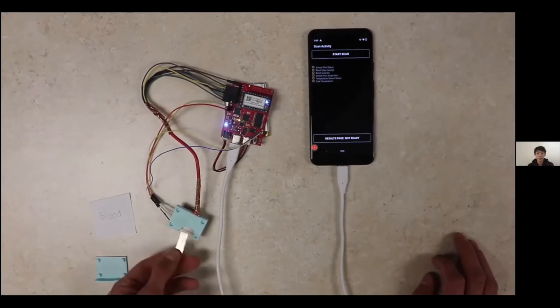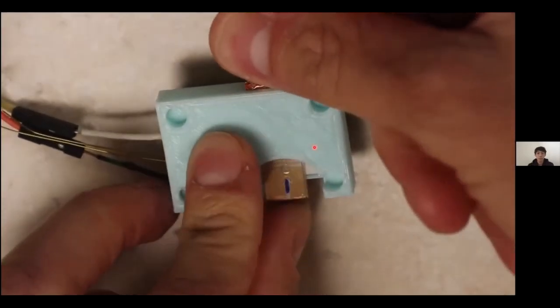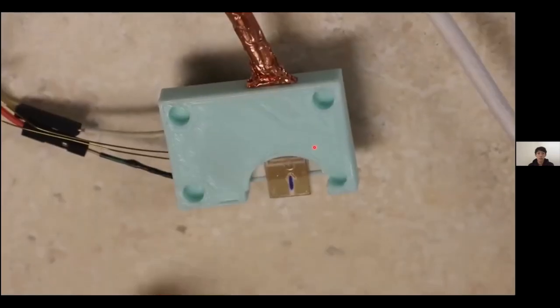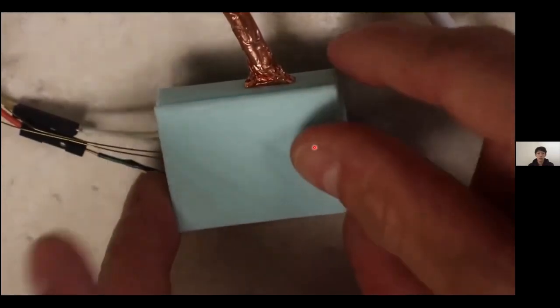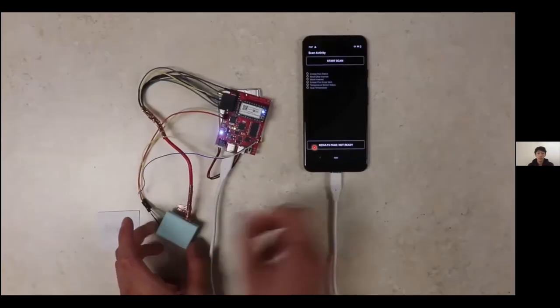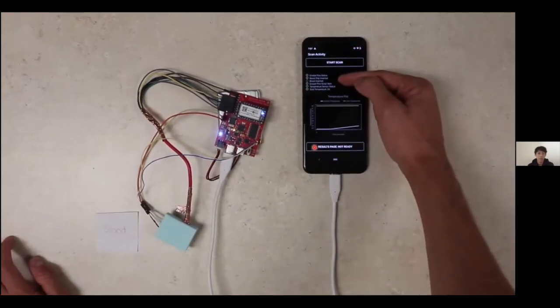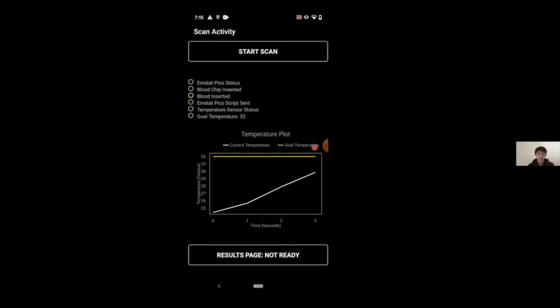From here, we insert the blood chip. Then what we do is we insert the blood, put that onto the chip, and then we cover it. Afterwards, we click Start Scan. Here, our status information turns green to show us where we're at. Then, the current temperature approaches the goal temperature.